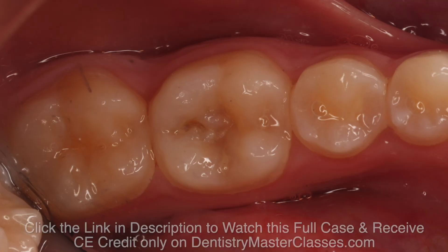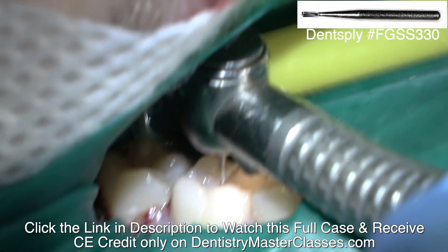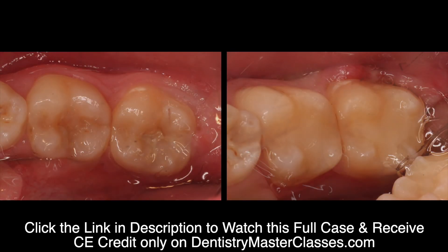Now this is the lower right. You can see the decay underneath here. Got the rubber dam. So I'm just opening that up so I've got direct access — I don't want to have to go under a cusp to remove the decay. That's the Dental Minute. These techniques work and they work every time.